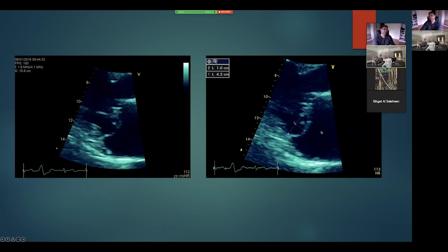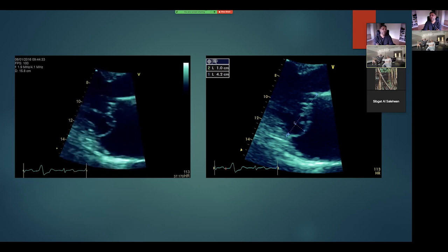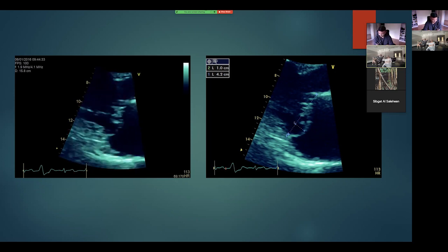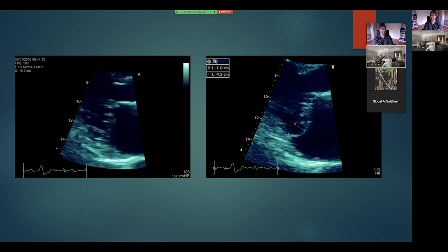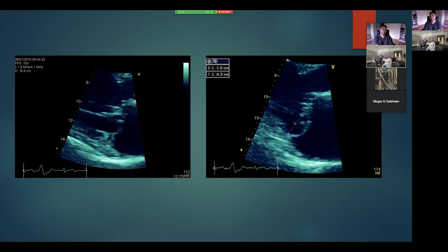So to summarize, we didn't really get all the views of the ventricles, but these are the important mitral valve views. Well, you can get the answers. Mitral valve prolapse involving predominantly the P2 scallop with an anteriorly directed jet, looking like moderate regurgitation at least.